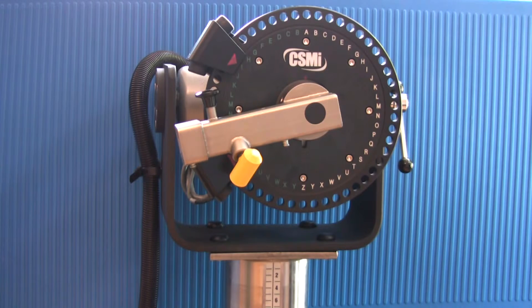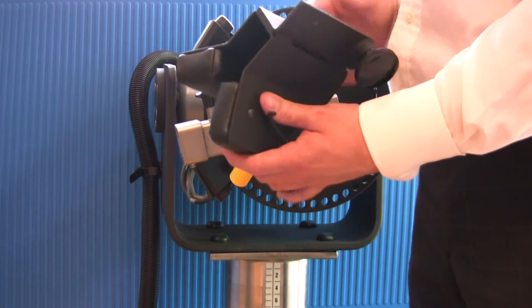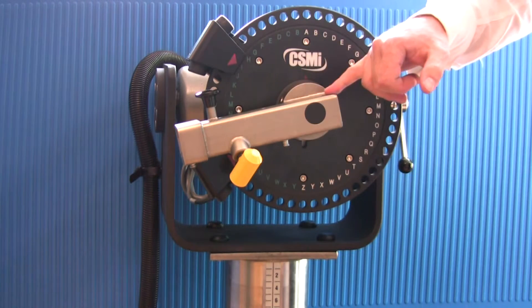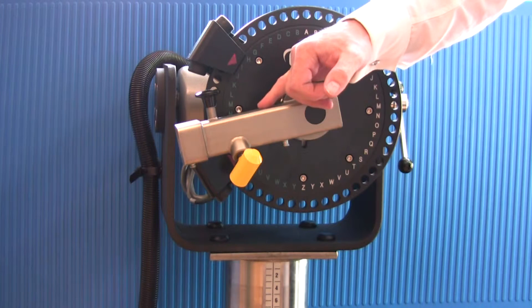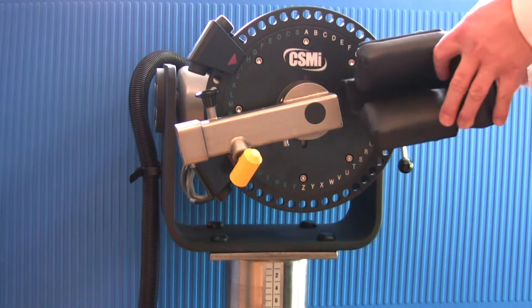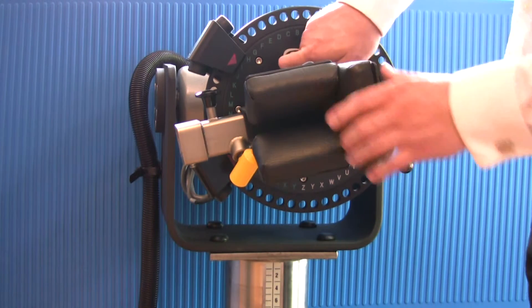Install the elbow stabilizer pad onto the short end of the input arm first. Line up the screw with the groove and insert. Secure with the locking screw.